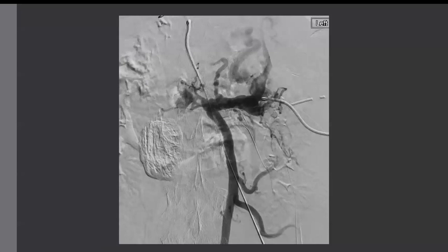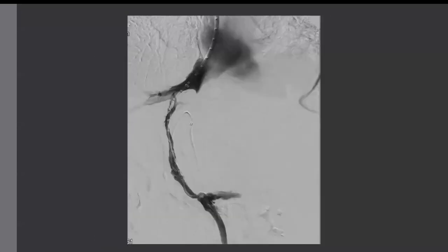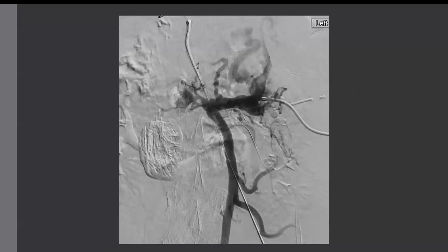You have to find the right outflow because, again, there's all these little vessels here that are functional but abnormal. You don't want to create a TIPS or recanalize one of those vessels because, again, they're small and they're abnormal and they're not used to dilating up.